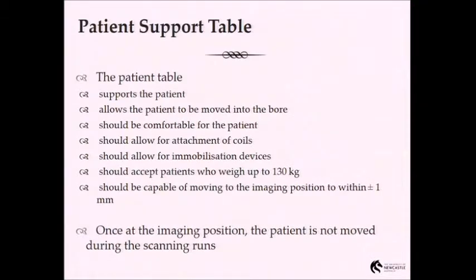So changing those things on the console, then uploading it to the computer system and then running an individual scan. So just a little bit about the patient support table. Obviously it supports the patient, it allows them to be moved in and out of the bore. If you've seen an MR scan, the table is out of the scanner, the patient gets on, and then you incrementally move them in.